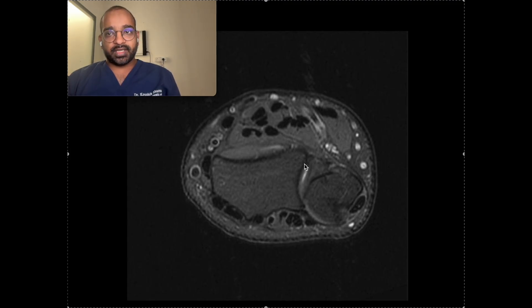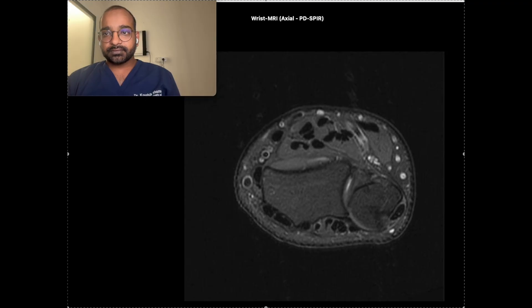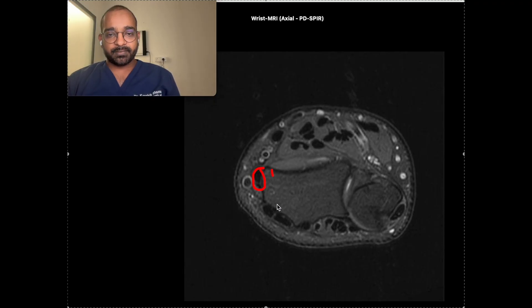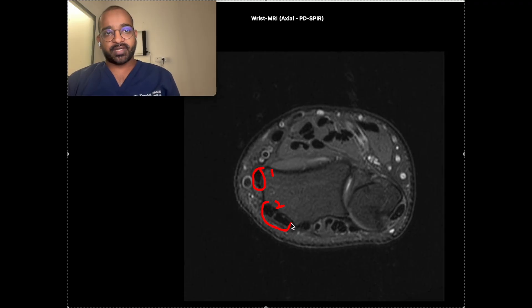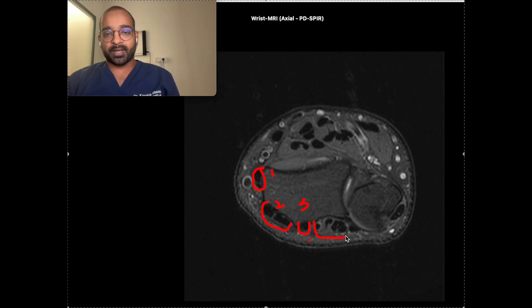So the first compartment has abductor pollicis longus and extensor pollicis brevis tendons. The second compartment has extensor carpi radialis longus and brevis tendons. The third compartment has extensor pollicis longus tendon.